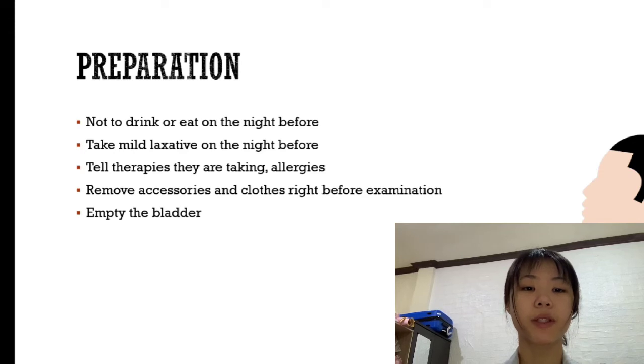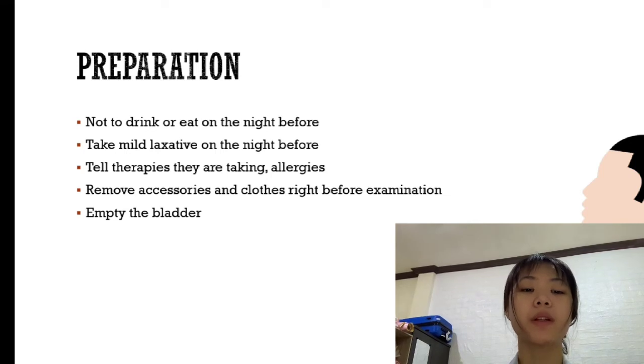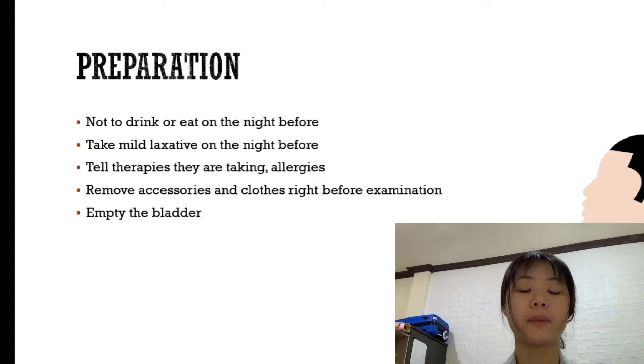My name is Johanna Kori. My student number is 107. Before doing the intravenous pyelogram, there are some things that the patients have to prepare, and the doctor will give the patients detailed instructions about it. First, on the night before, the patients will likely be instructed not to drink and eat after midnight, and patients are also asked to take a mild laxative in liquid or pill form.